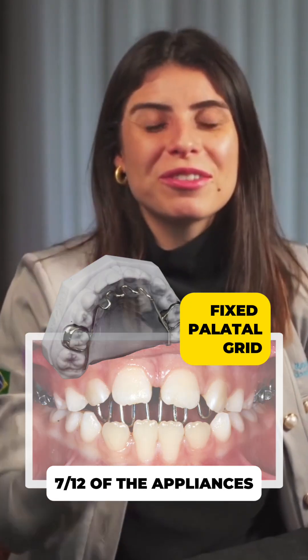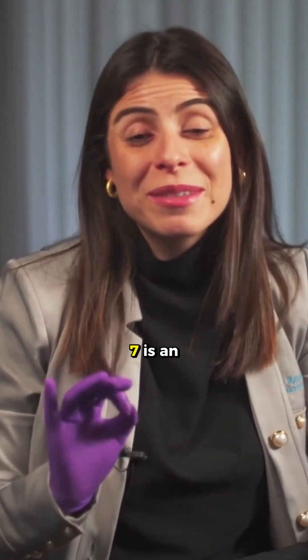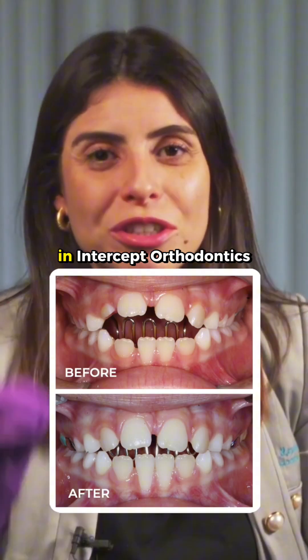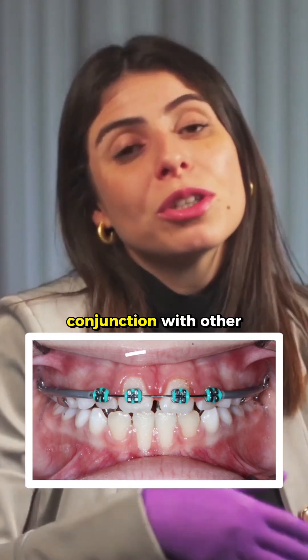Episode 7 of our series on appliances that we have been following in these last few days. The appliance I am going to present today in episode 7 is quite commonly used in Interceptive Orthodontics, and it can be used on its own or in conjunction with other appliances. Let's get to know it.